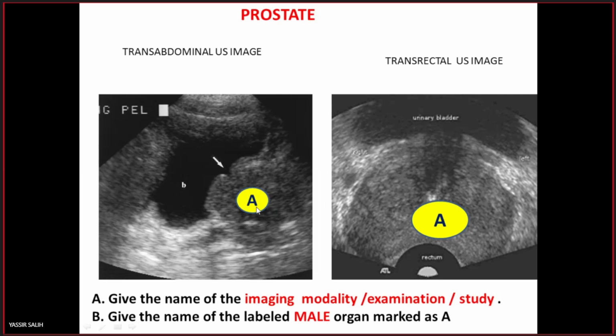Like your colleague said, the imaging modality is ultrasound. But for the imaging study or imaging exam, what is your answer? Transabdominal. Transabdominal ultrasound for the prostate, or for the pelvis.